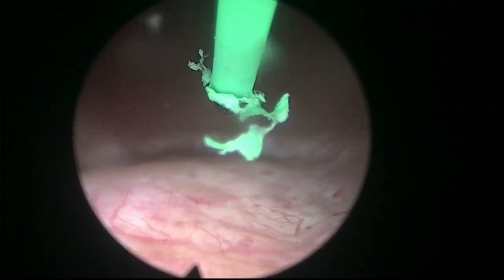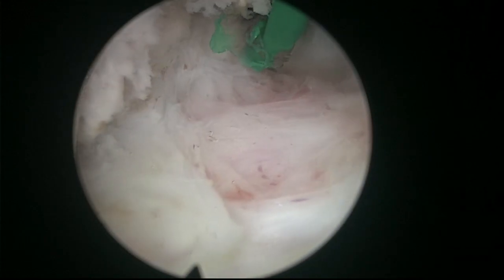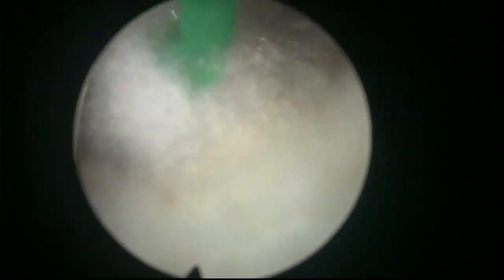And on the other side, we could see that we were more medial than the UO, but here we are. So we're right at the edge. So I'm going to keep my incision at the bladder neck a little bit more medial to make sure that we don't damage the UO.